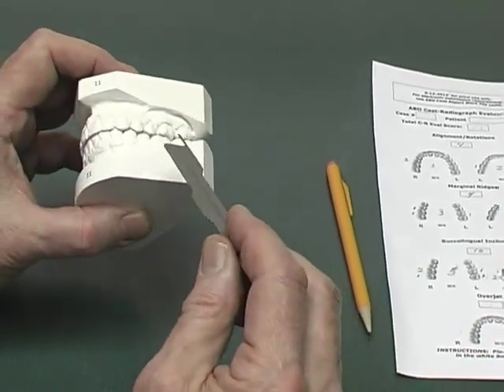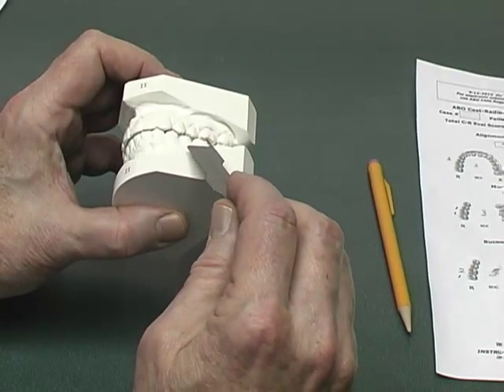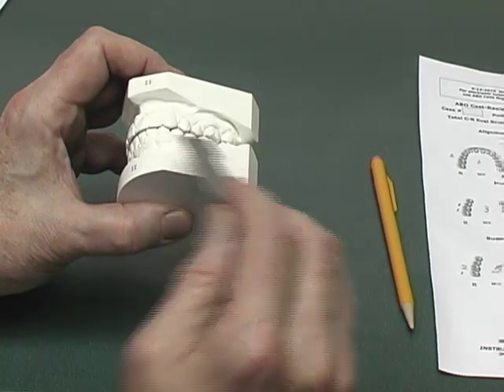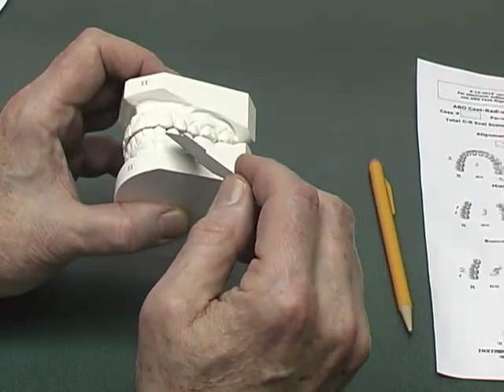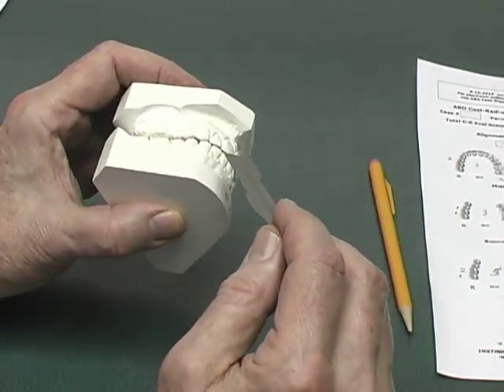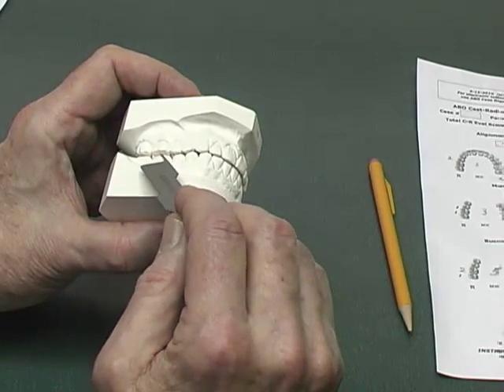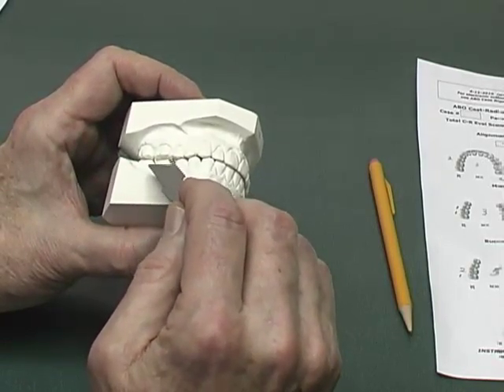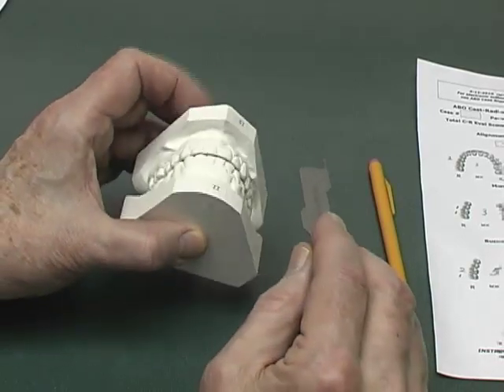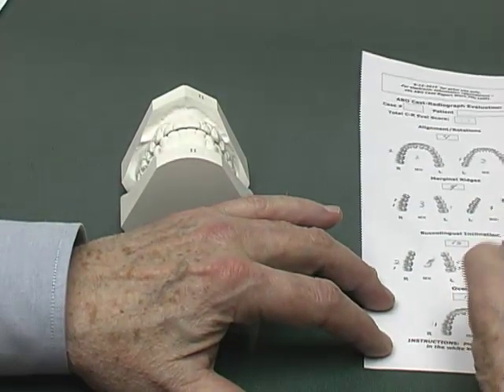Moving to the left posterior teeth, the mandibular buccal cusps should be in the central groove of the maxillary posterior teeth. It's very difficult to measure directly because you basically can't place the measurement gauge in that location. In this case, the left side looks good. On the right side, it becomes immediately obvious that the overjet of the right first molar is not correct — the mandibular buccal cusp tips are about one millimeter or less from the central groove. So this will score one point, giving a total overjet score of one.